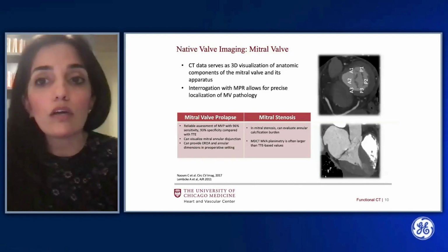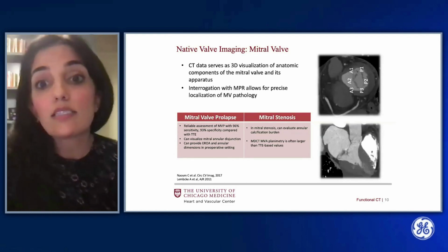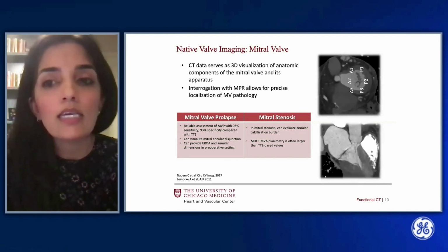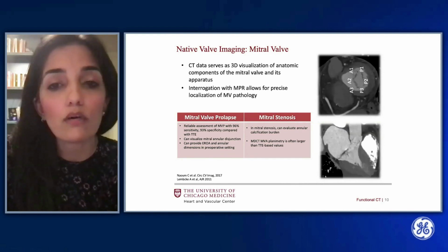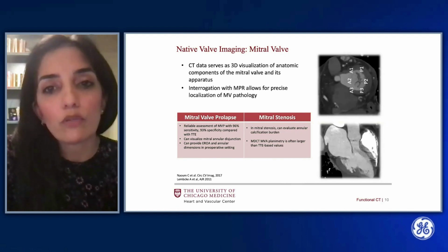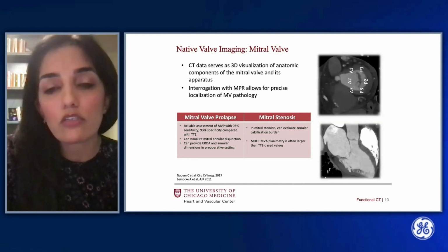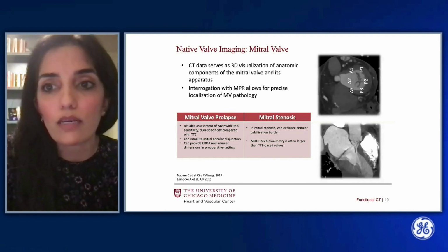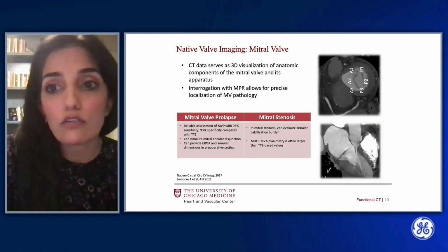Extending beyond the role of pre-structural heart interventions and entering into the valvular space, dynamic CT has a lot to offer, particularly in the assessment of mitral valve disease. This is again due to the ability of CT to provide 3D visualization of the components of the mitral valve and its apparatus, which are further evaluable with multiplanar reconstruction to localize pathology, using a similar convention to echocardiography with a representative short axis cine image shown at upper right here. This is a frequent indication for cardiac CT at our own institution.